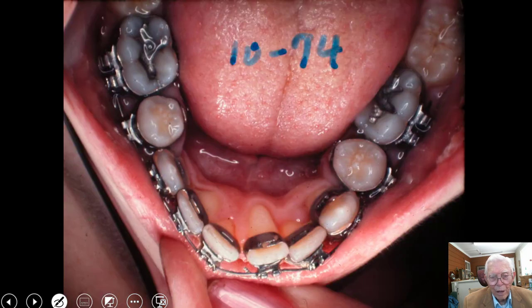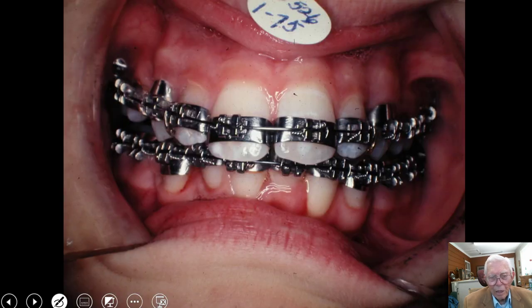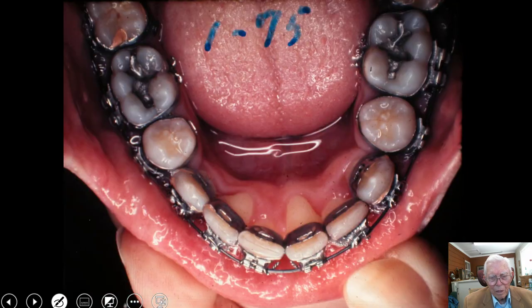We bring the roots back as we do that. Here's 1974 — two years from the beginning. In 1975, the upper centrals are lined up pretty well. The lower cuspids are now back, and we're torquing the central — bringing the root in and lining it up with the other teeth. Here are your cuspids, rotated and sitting at roughly the same expanded position. This is 1975.